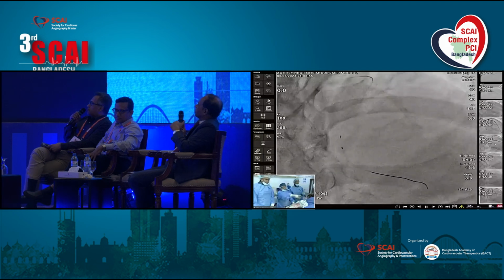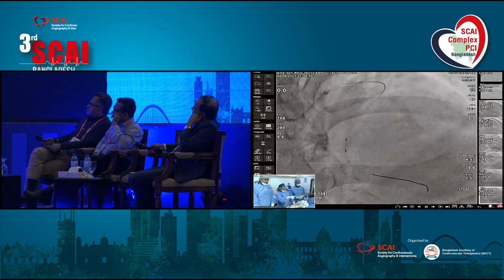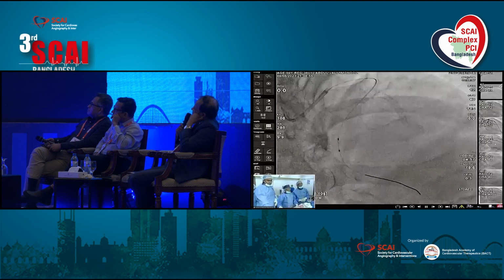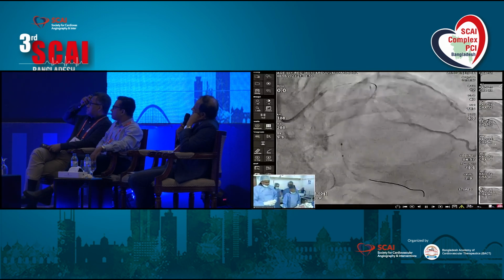It's not the RCA, so it is a distal, non-dominant vessel. It's 2.5 millimeters. I think it's not that small. What is the length? It is 15. So a 2.5 by 15 millimeter stent you would like to put? Right, yes, 2.5 by 15.